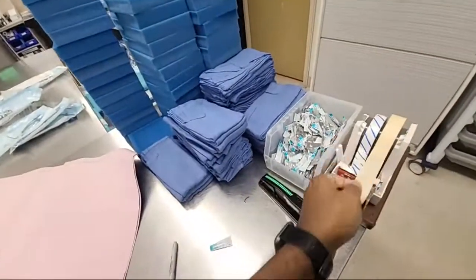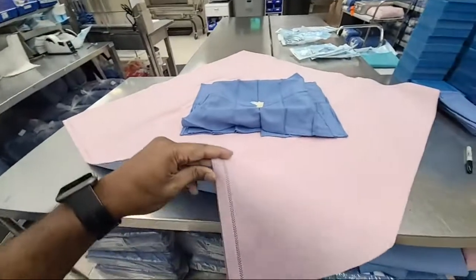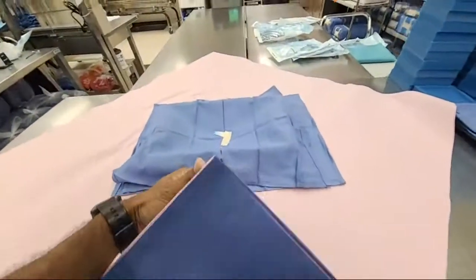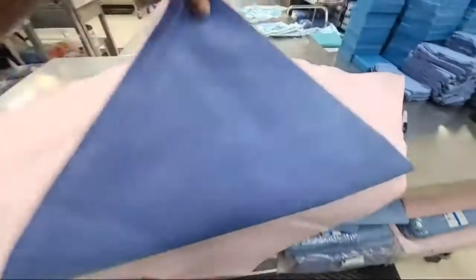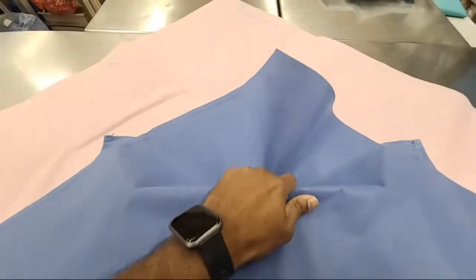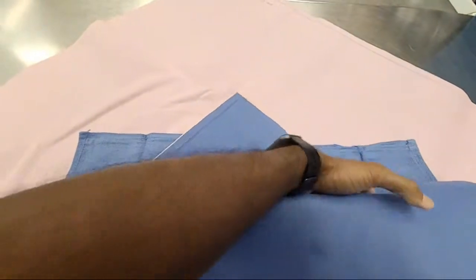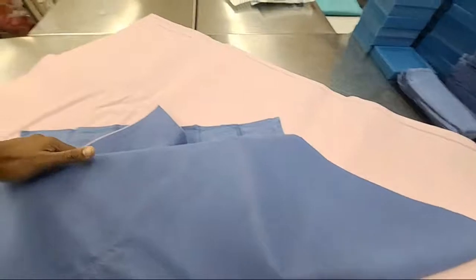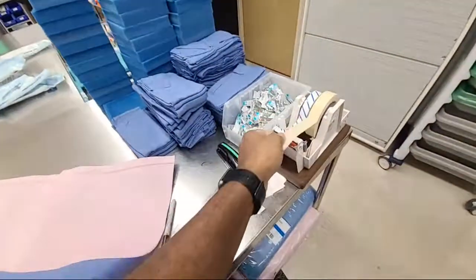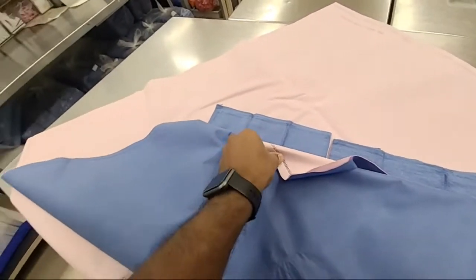And then this is steam, so we're going to use the steam CI. Tape it to the top. And let's see if I can do this ripping one-handed. This is weird. Get the corner. Pull it back. Go over. I'm going to tuck that part under. Now this part, sometimes I leave it, but some people say that you should do this. So I'll just do this for the video.